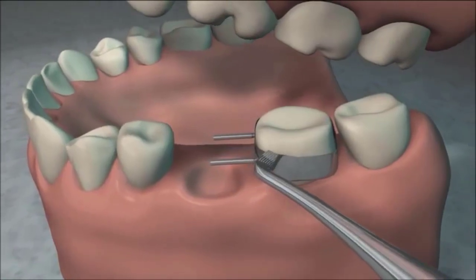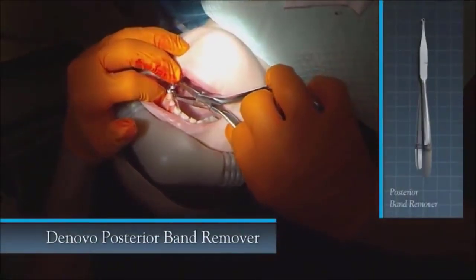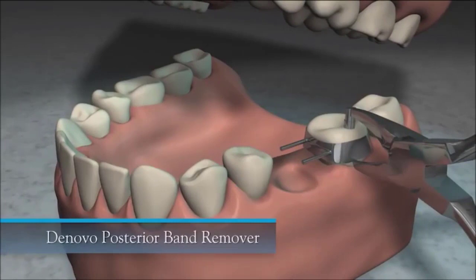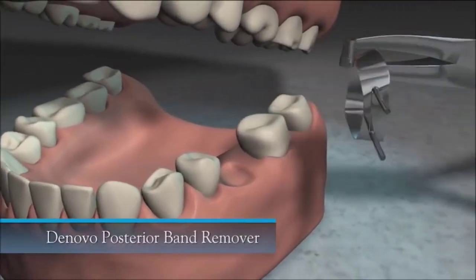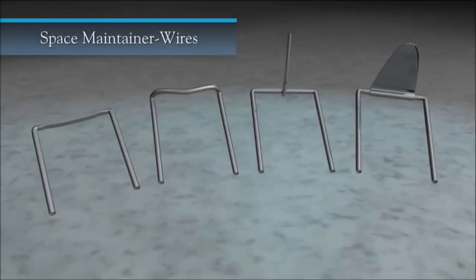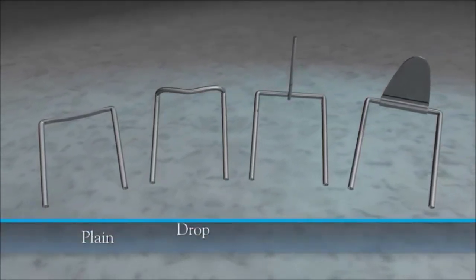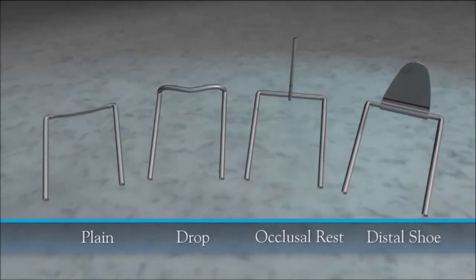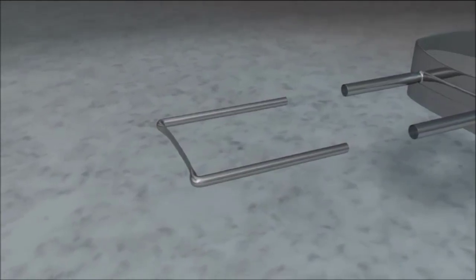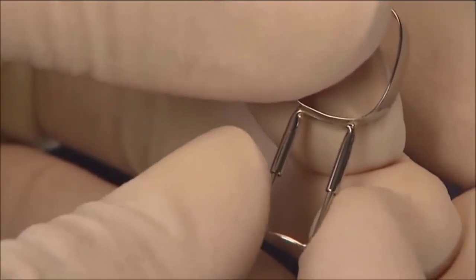The band seater has a serrated tip which minimizes slipping while exerting pressure. It can also be used to contour the band onto the occlusal shelf. In some cases the band will need to be placed subgingivally. To remove the band, use the De Novo posterior band remover. There are four types of wires used with De Novo space maintainer bands or crowns: plain wires, drop wires, occlusal rest wires, and distal shoe wires. Plain wires are the most commonly used, offering low cost and adaptability to a wide range of cases.